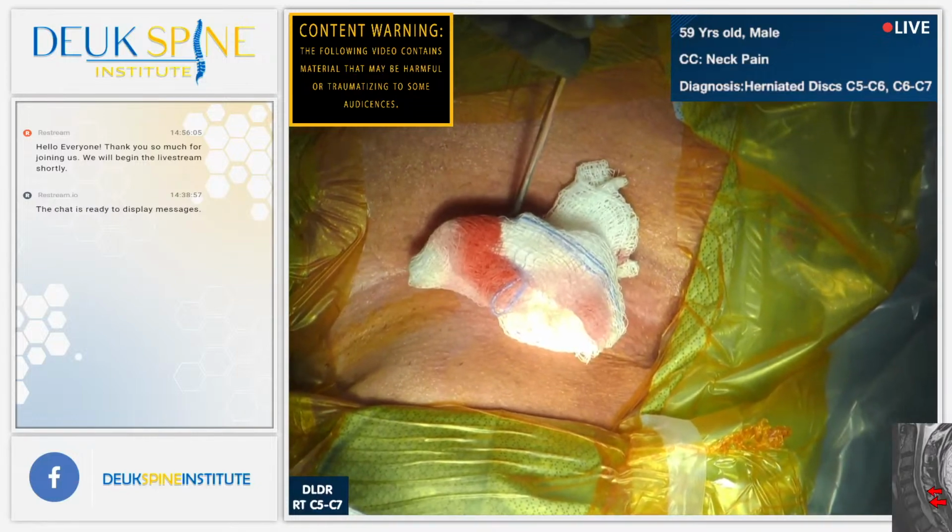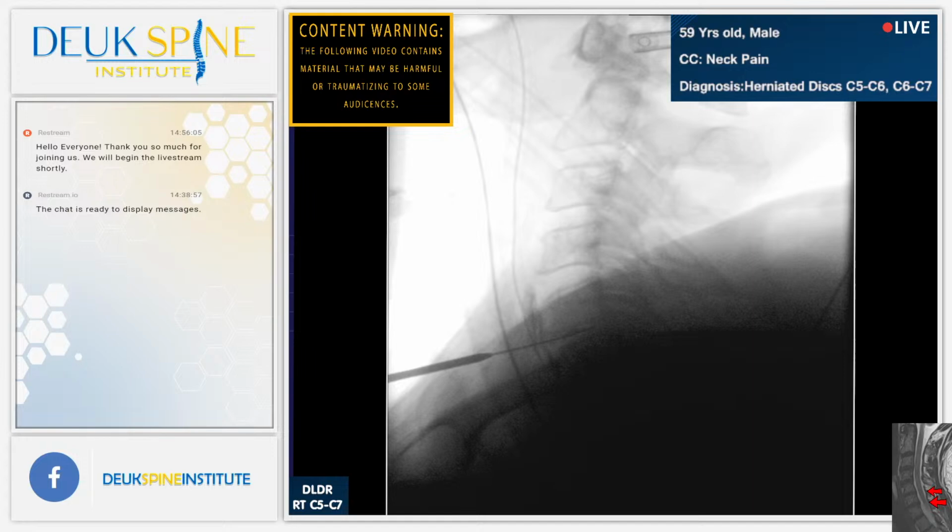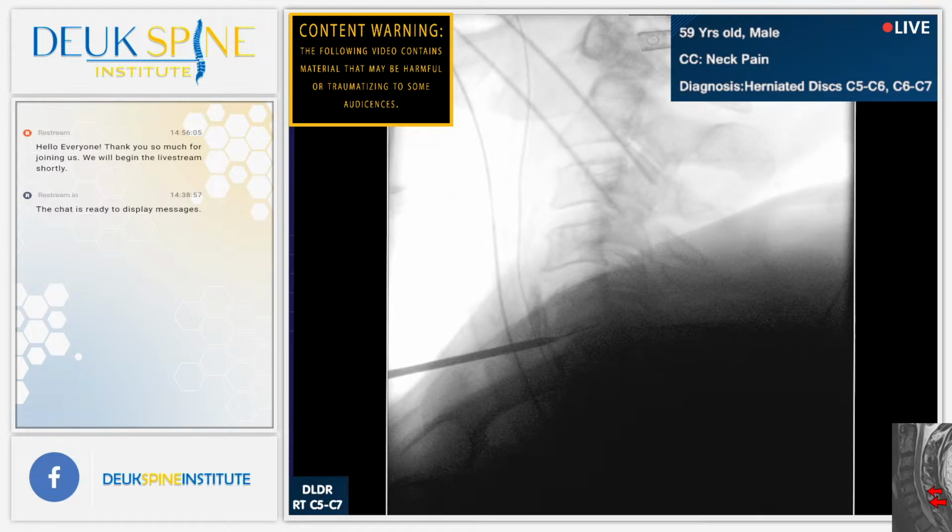Shot. Beautiful. See guys, that was the problem the whole time. That left shoulder was just too high. He was catawampus on the table. You know what I mean by catawampus? Like this. That's the problem. We just needed to drop that shoulder and we're fine. Because we got the preoperative x-rays and they look great. 2, 3, 4, 5, 6. Beautiful. I think we're going to be able to get 6, 7. I feel good.